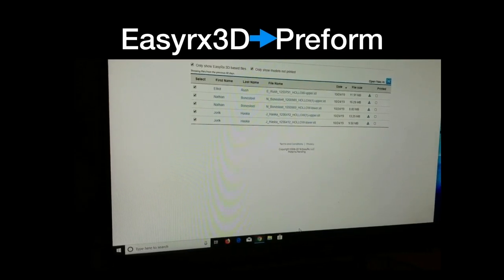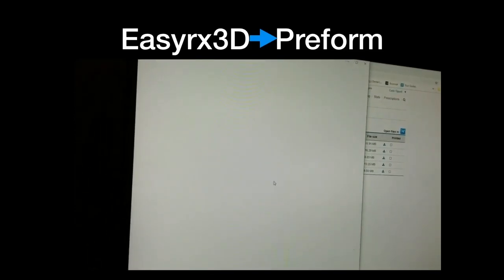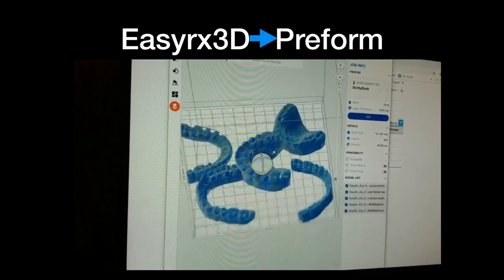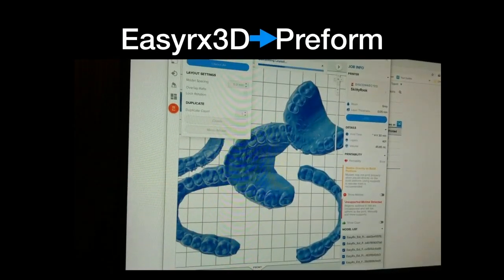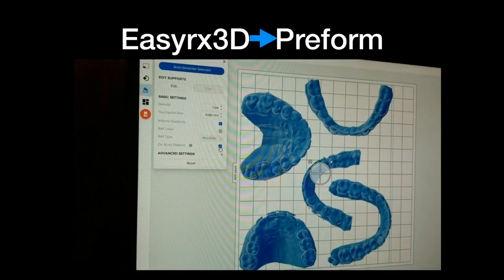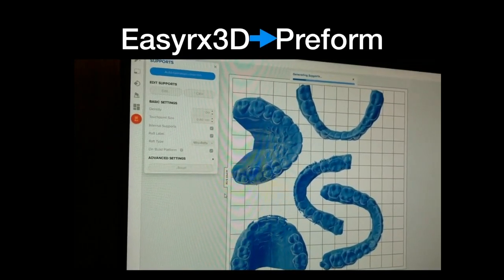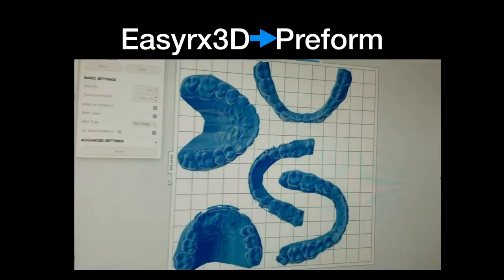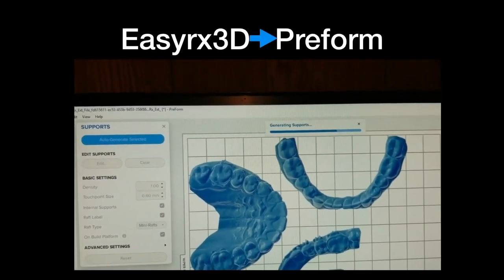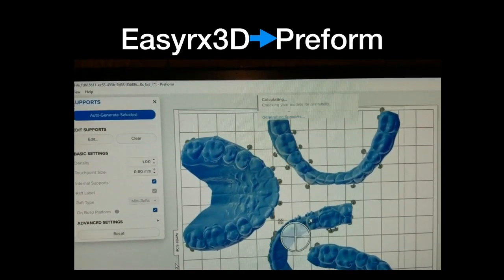So then it goes into my computer and opens my PreForm software. And I was going down here because it'll pop up there in a second. And then it'll take all those models and throw them into my layout software. So I don't have to download them to my computer and then reload them in there. It pops open. Now this is sped up, I'm not this fast. But you can lay them out. I just do automatic layout and then I do supports. This whole video is actually 2 minutes, 27 seconds long. So it really doesn't take long to send them to the printer.